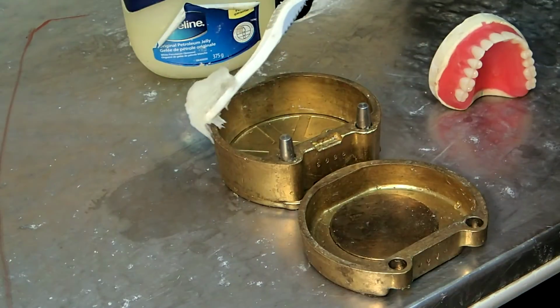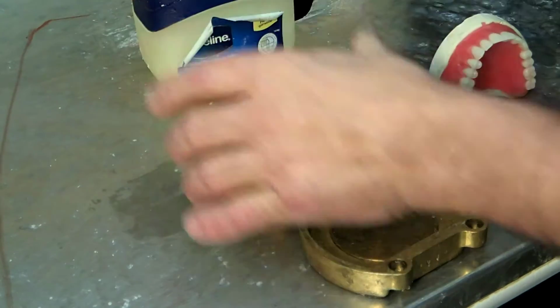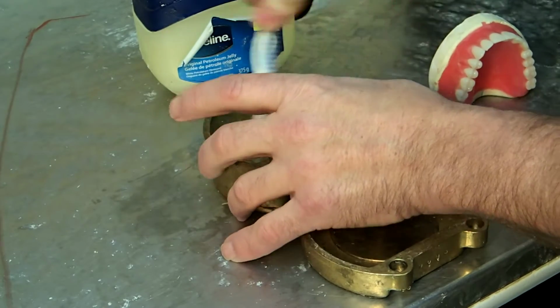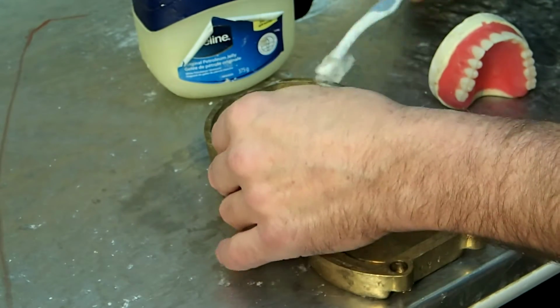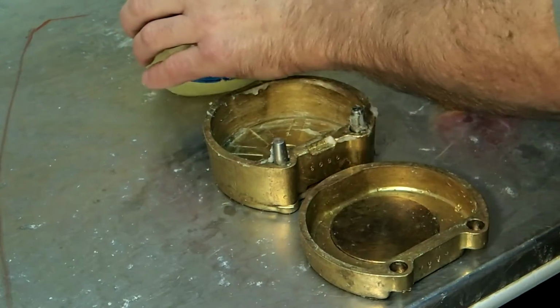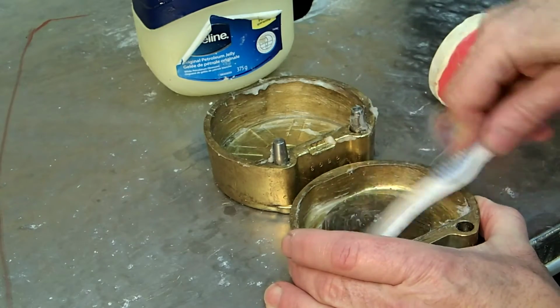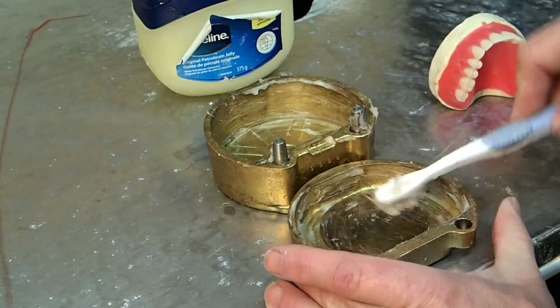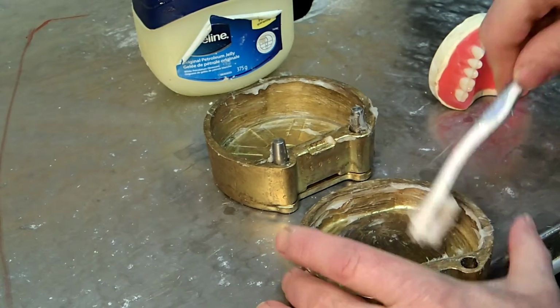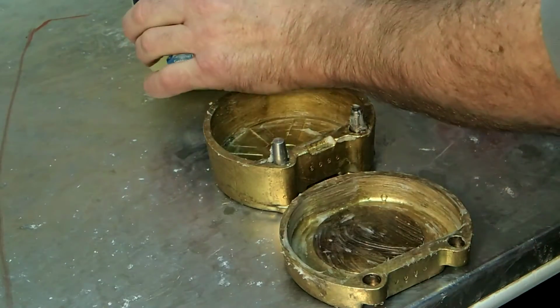And Vaseline. Vaseline is going to act as our separator. I'm going to take a good bunch of Vaseline and I'm going to Vaseline the inside of the flask really well. This is where you get to use a lot of Vaseline. You don't want your stone to get stuck inside the flask when we're finished. So you can put this on pretty thickly. Everything else that we do with that Vaseline, we do just a very thin layer. For this, I'm going to do a pretty good thick layer.